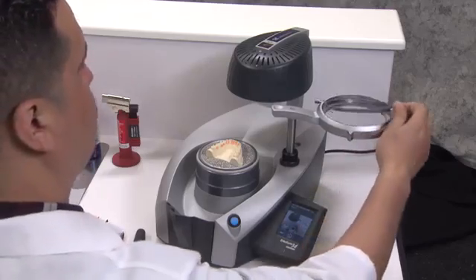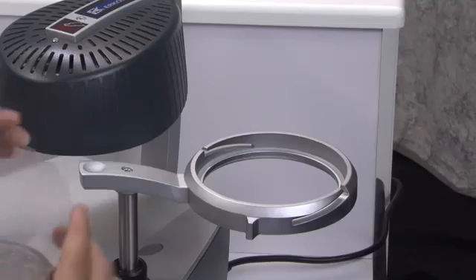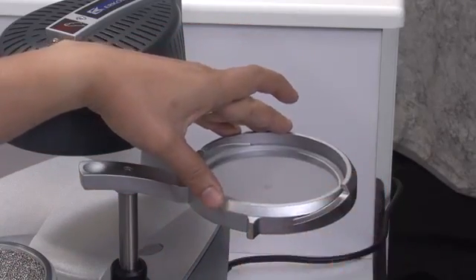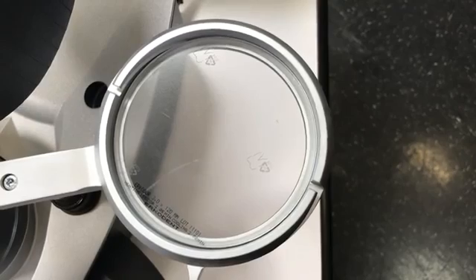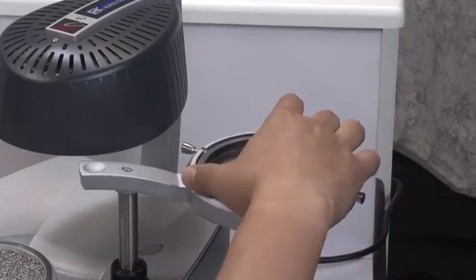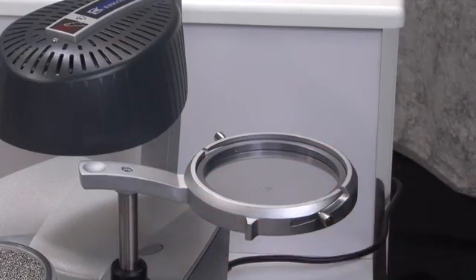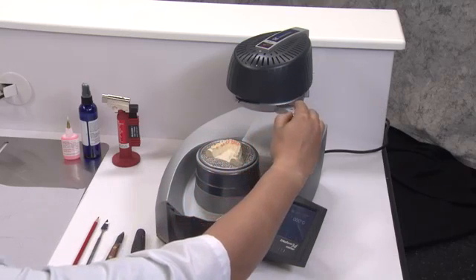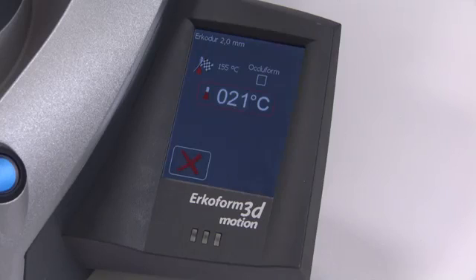Remove the locking ring from the foil holder. Place the foil label side down into the foil holder. Reattach the locking ring. Turn the foil holder underneath the heating element. This will automatically start the heating cycle.